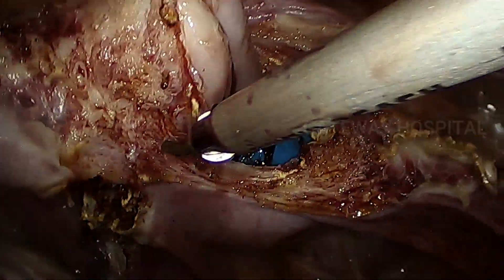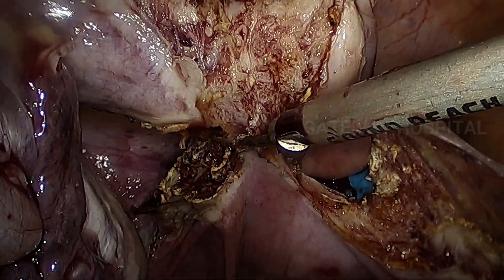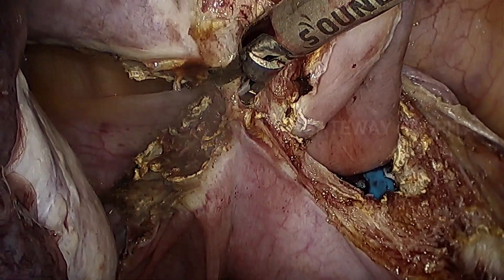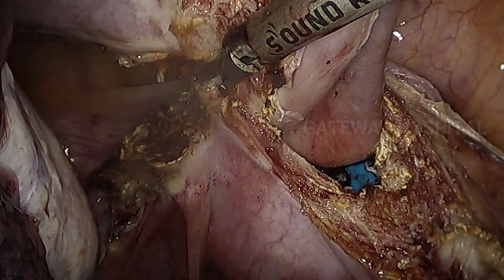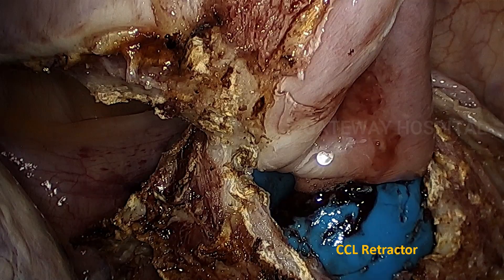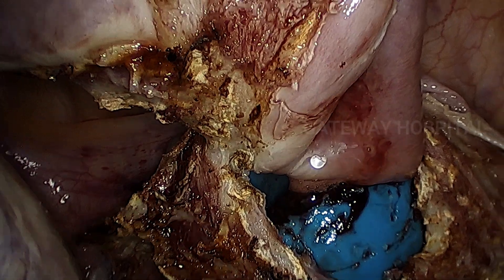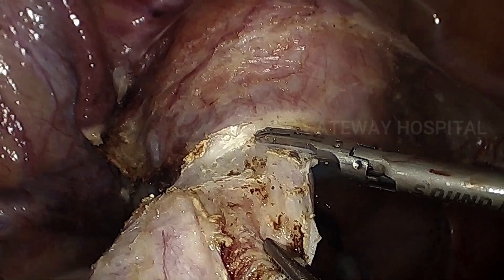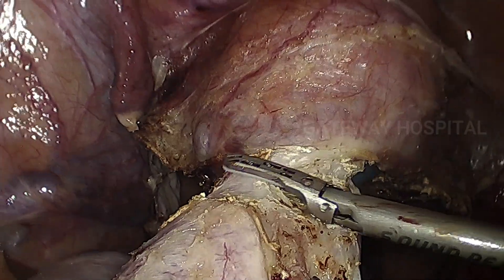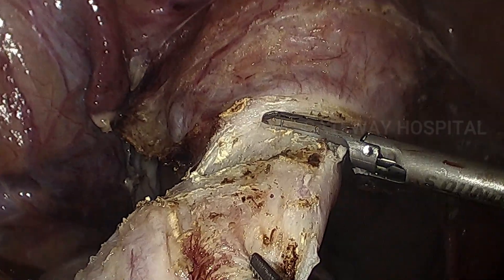You can see the entire cervix coming along with the uterus specimen. During this time, you should not accidentally injure the divided left uterine vessels, so you stay close to the cervix and uterus. You can appreciate the cervix, which is completely removed. We are extending the division on the anterior aspect. Before finally dividing, you can relax the traction on the uterus and cervix so that the harmonic scalpel will not suddenly cut and cause bleeding.